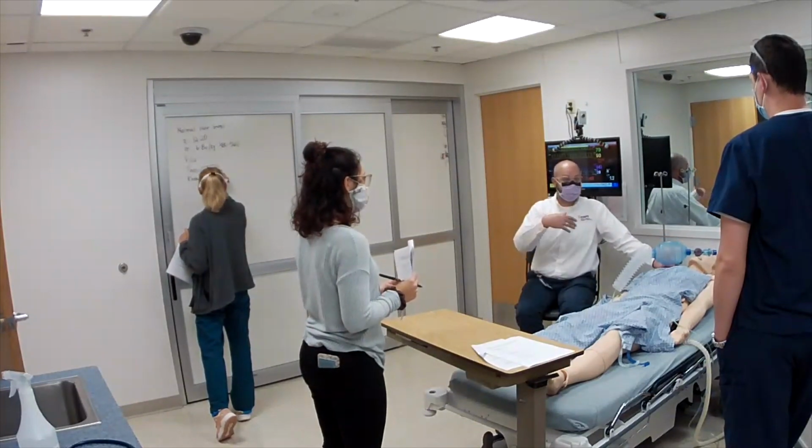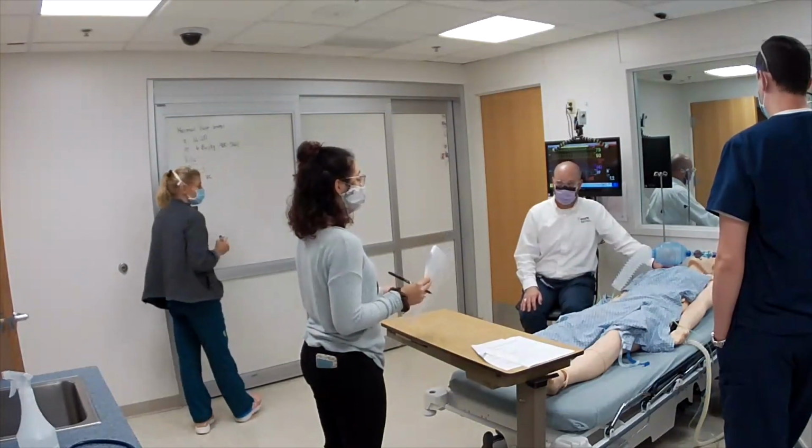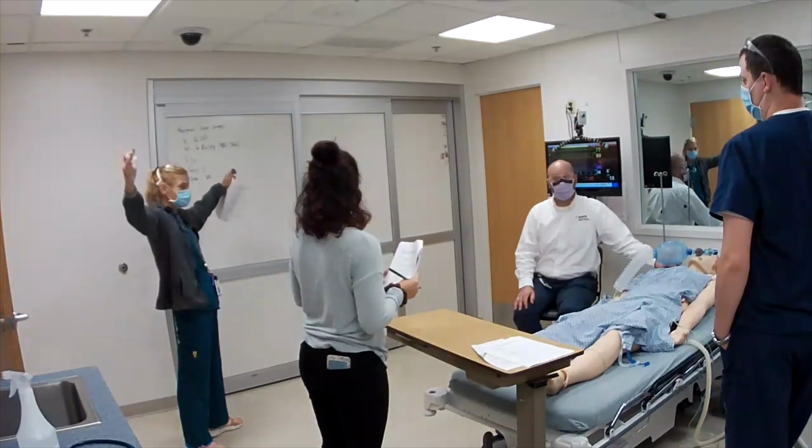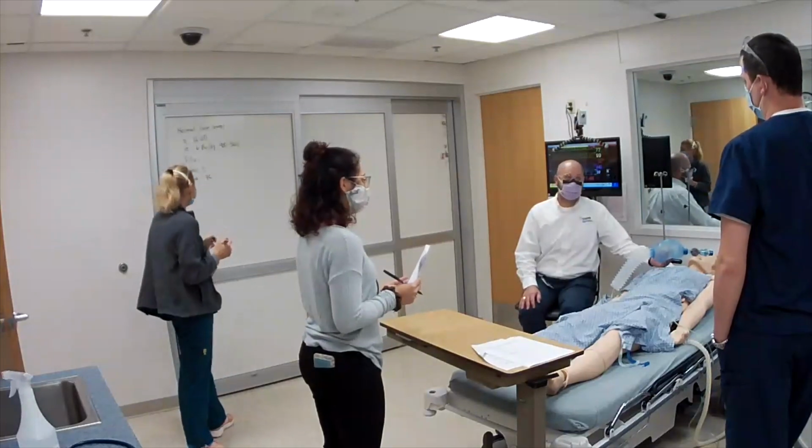There's no help. Or, well, it'll give them a breath. But you're getting the whole thing, aren't you? Yeah, exactly. So it can be kind of dangerous if the patient is breath trapping, right? I guess no support is fine.